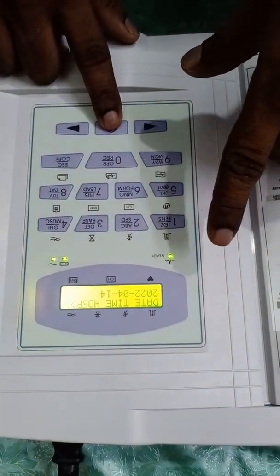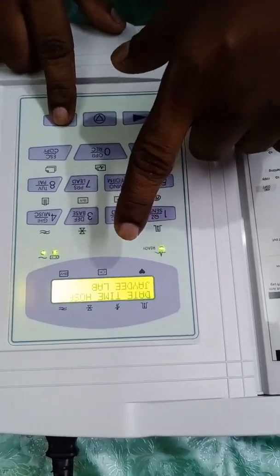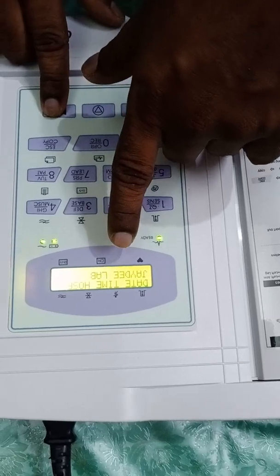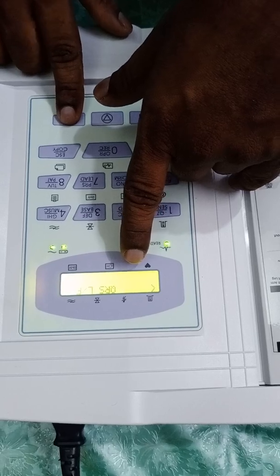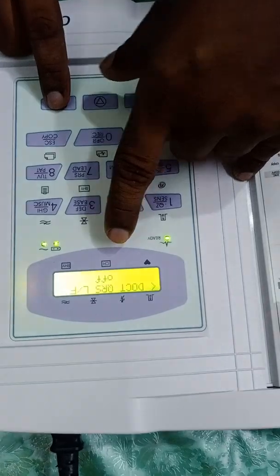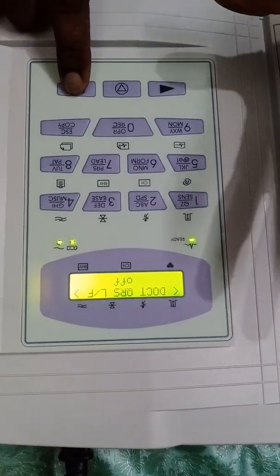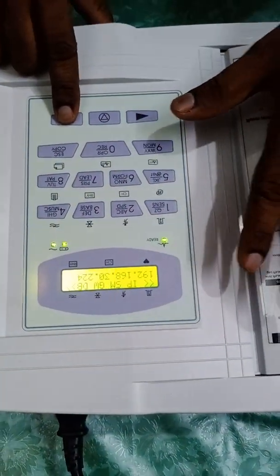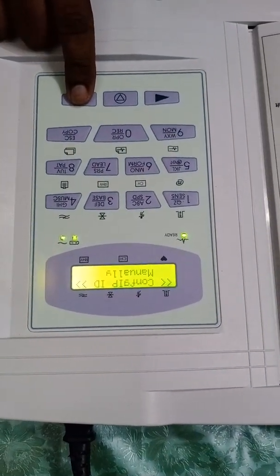In the system settings you can configure the date, time, and hospital name — I have entered my client's name there. You can also enter the doctor name. There is a QRS alarm setting: if turned on, the machine will alarm when it detects the QRS complex wave. We are leaving the IP setting since we are not connecting to any LAN or database.